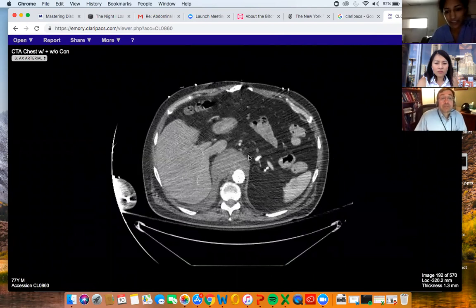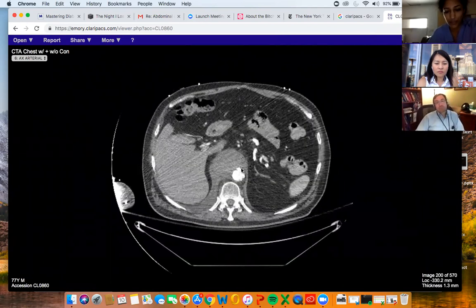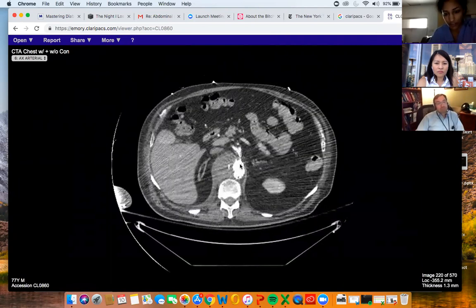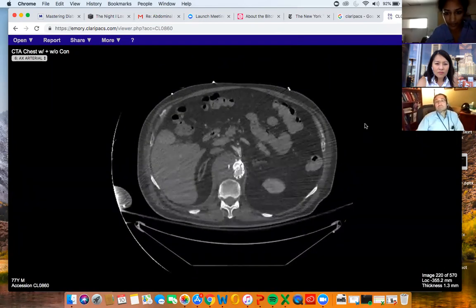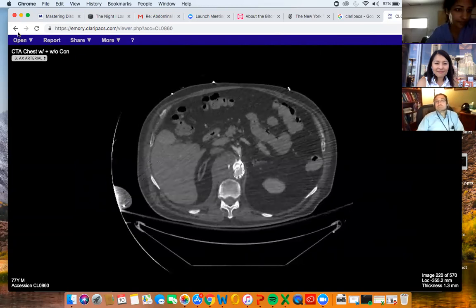Okay, so this is the post-op. There's a stent there. The aneurysm has been excluded. There was no leak. And then you can see that they also put a snorkel. They put some stents across there as well into the SMA and the celiac axis. And then they asked us to put a drain into this area here.